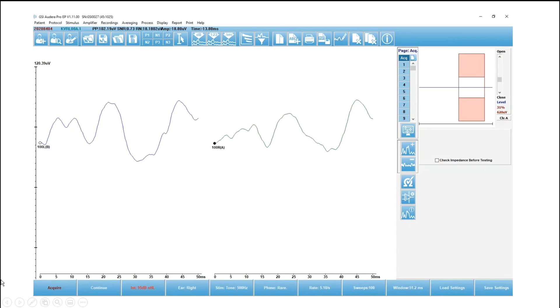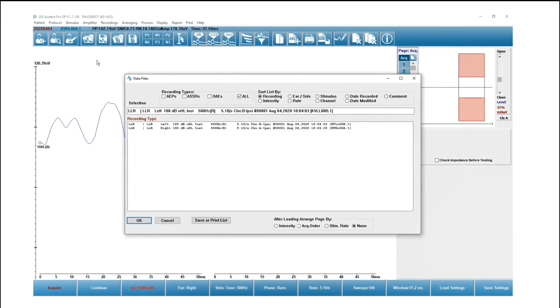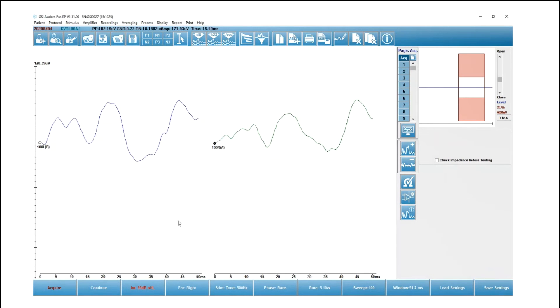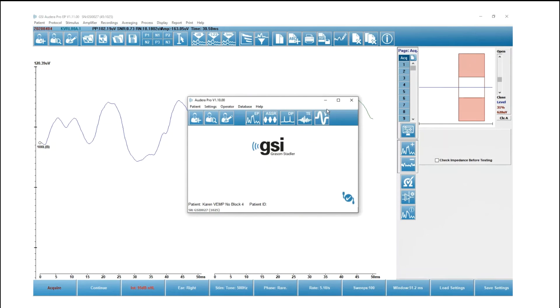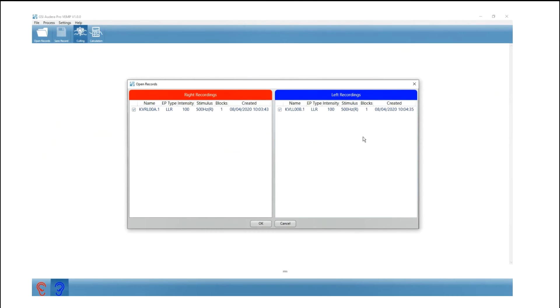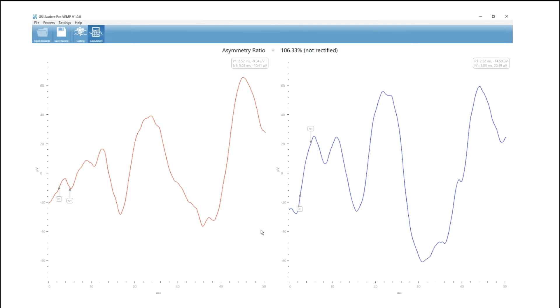So this is the EP module. There are already two waveforms — a right and a left C VEMP — that were already collected. Those are the only two waveforms for this patient. I'm done with my VEMP; these look pretty good. I'm going to navigate over to the analysis module. The first thing that will appear is the open records dialog. If you have more than one VEMP per ear, you'll see a list here. I only have one, so I'm going to select OK.